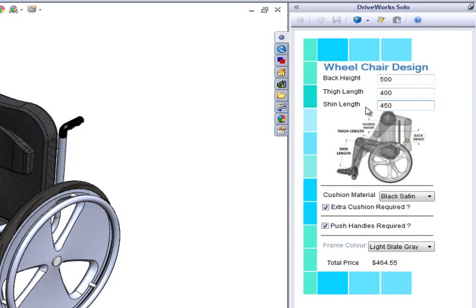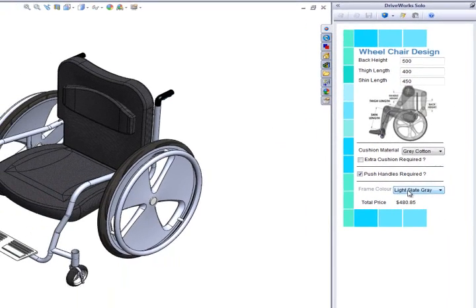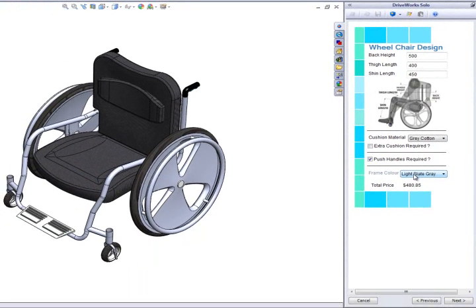We can now choose our cushion material, whether we would like an additional cushion to support our back, and whether or not we want push handles on the wheelchair. Finally, we can choose the frame color.